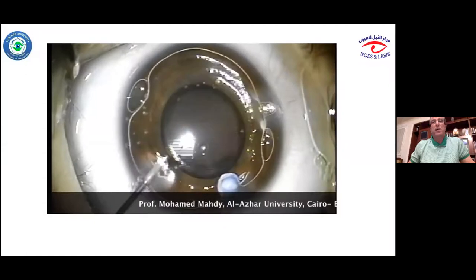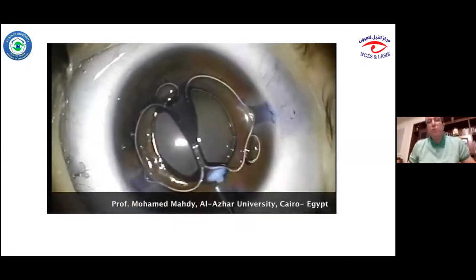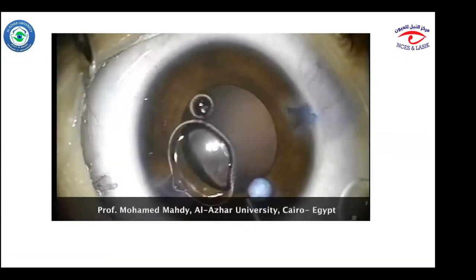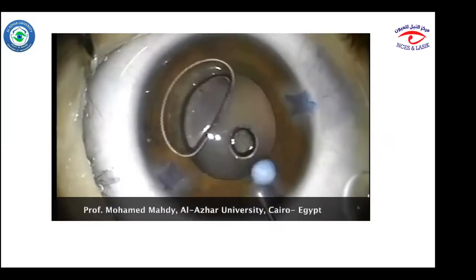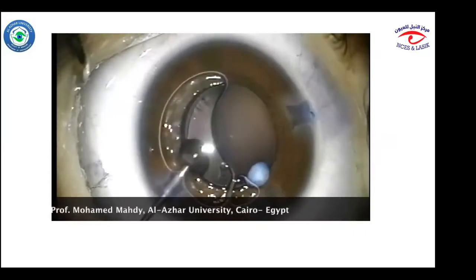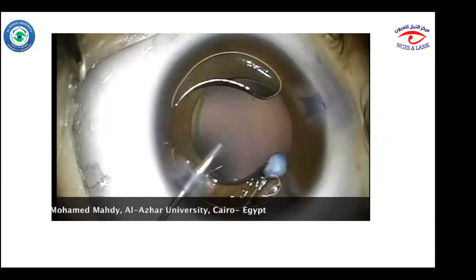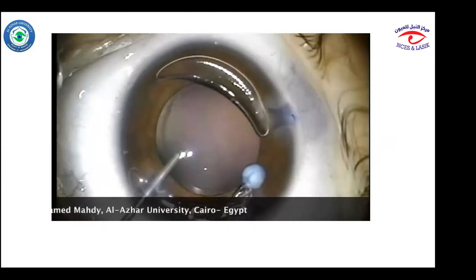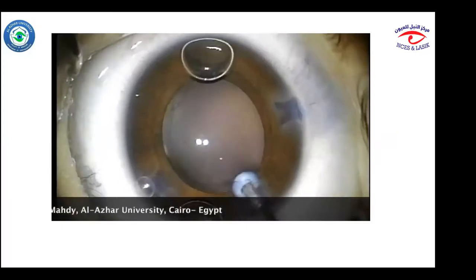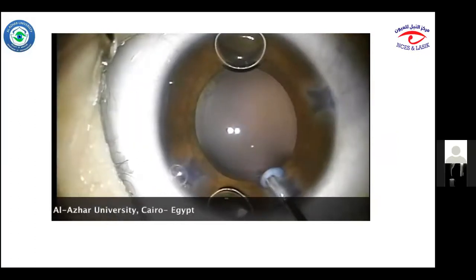I inject air, then I inject Trypan blue in order to stain the posterior capsule. And then I remove the fluid. And this is a remnant of the opacified part of the lens. I will aspirate it with the viscoelastic cannula. Of course, we have to use a wide one. Then, once I have completed removing this part of the opacified lens, I will start to do the posterior rexis.